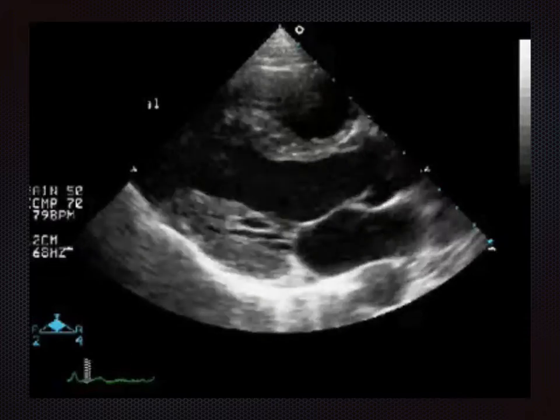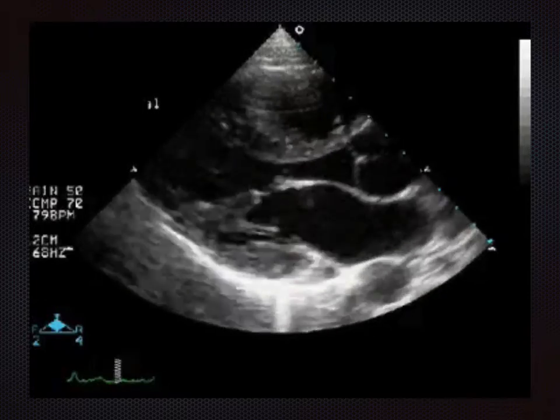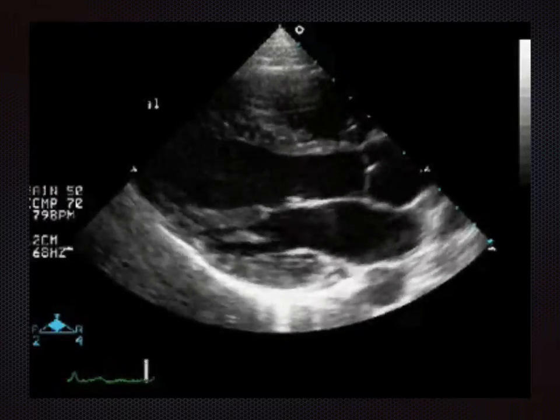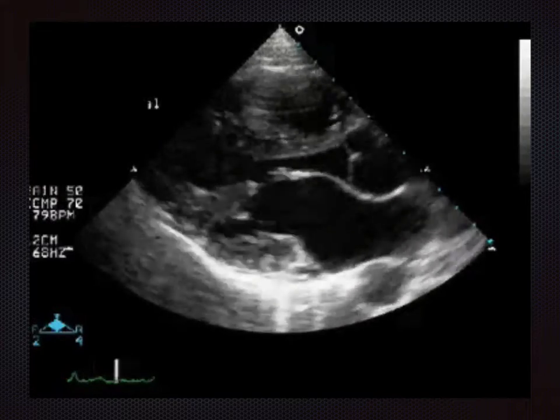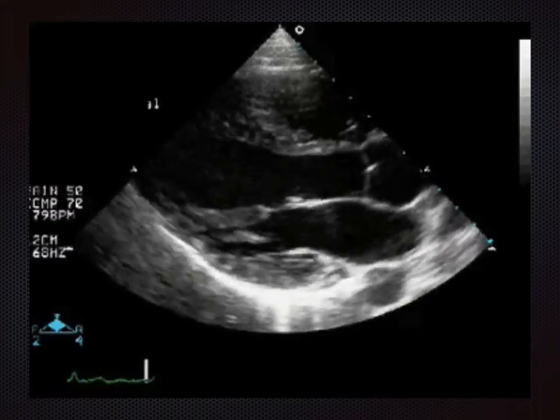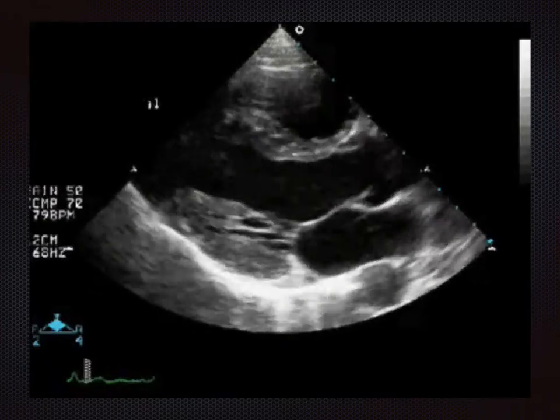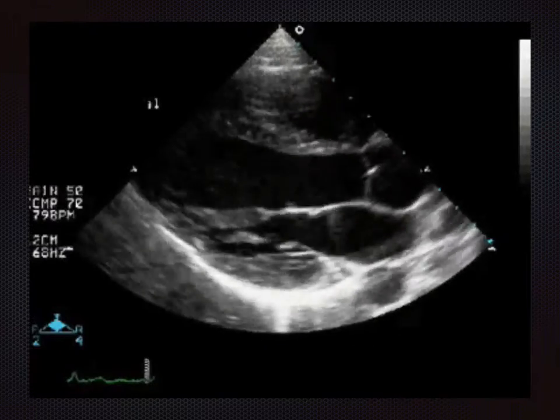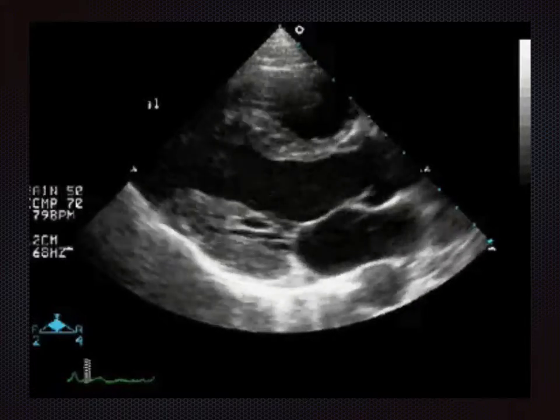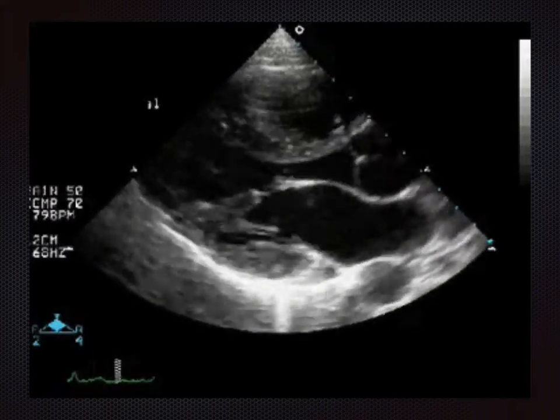So to the left of the left atrium is the mitral valve, and there's an anterior leaflet, which is the one at the top, and a posterior leaflet, one at the bottom, and they're connected by the chorda tendineae to the papillary muscles. Now the anterior leaflet is much more mobile, and you can see that as the blood flows through in diastole, i.e. the filling phase and relaxation phase of the heart, the anterior leaflet flips up and almost touches the septal wall at the top of the left ventricle. This is a good indication of flow and valve functioning normally.